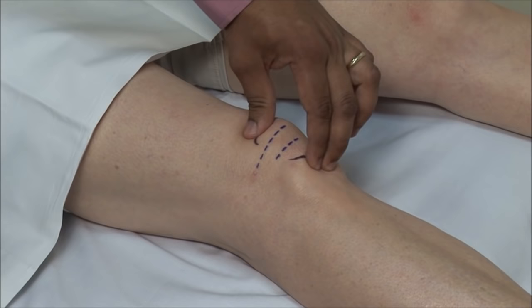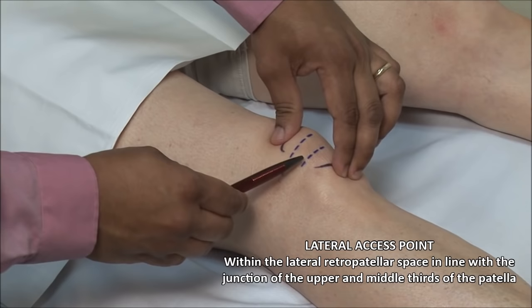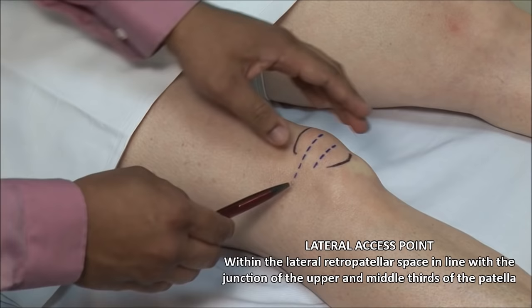Identify the superior and inferior poles of the patella. Lateral injections are done in line with the junction of the upper and middle thirds. Palpate the groove underneath the patella.